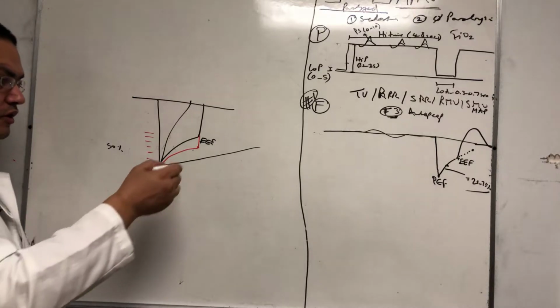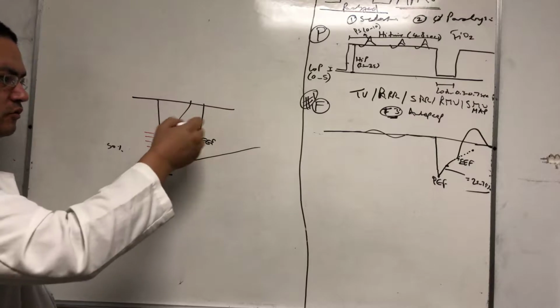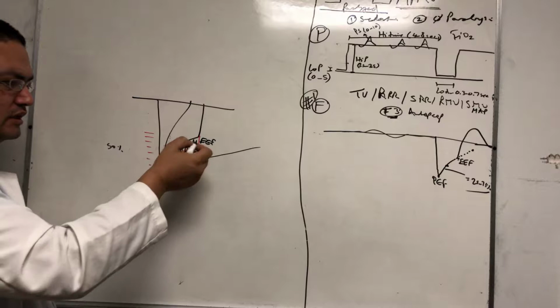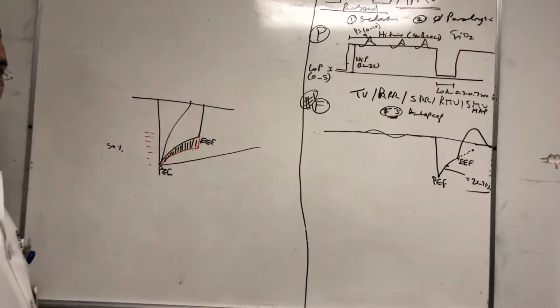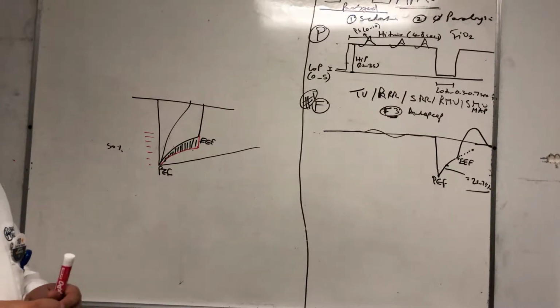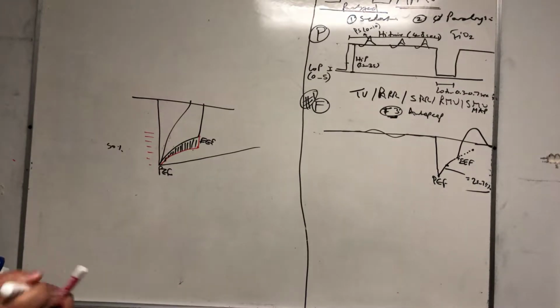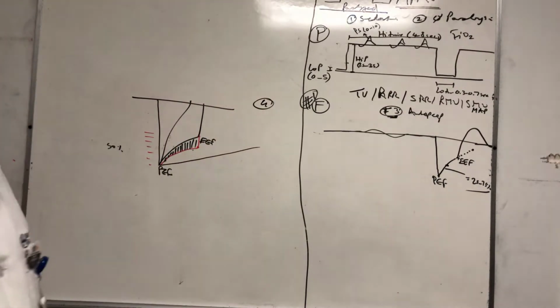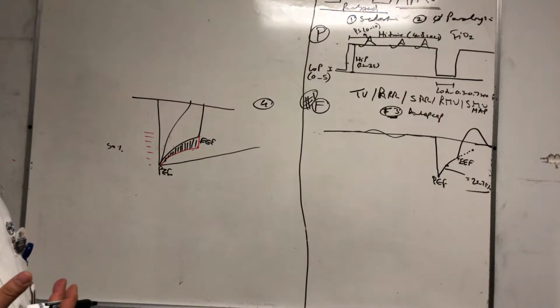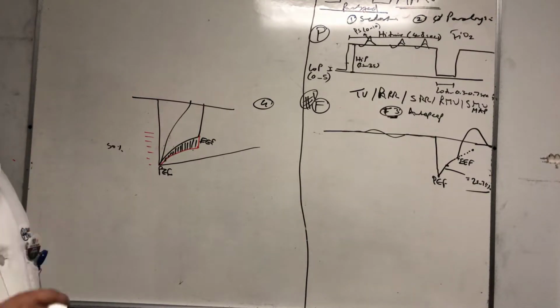In addition, just to understand it more, this is also an area under the curve. So whatever the tidal volume was here between the morning round and afternoon rounds, this actually was added to the tidal volume. You'll see it even on the tidal volume. That means the patient recruited. That happens all the time. This mode is a good mode of recruitment. So you see, that's another claim to fame, that it's another mode of recruitment here. I would say more than 95% of the time, that is the case, that the patient improved.